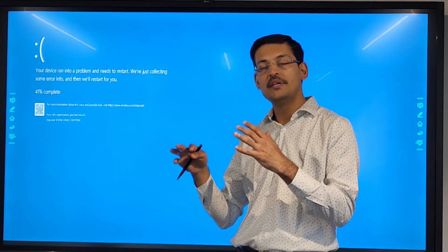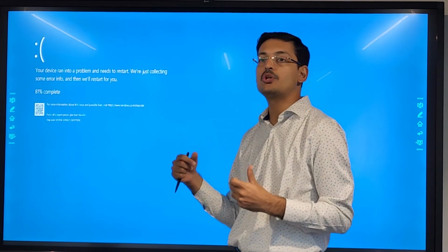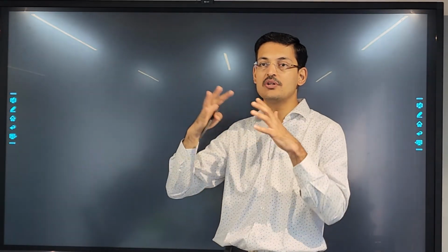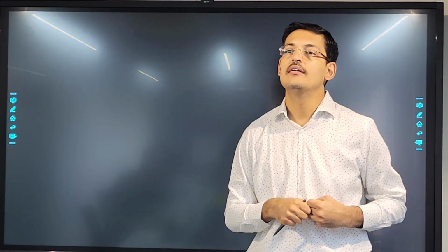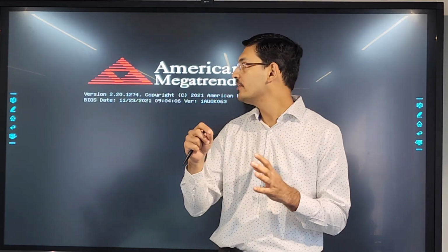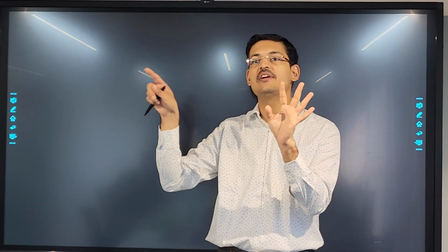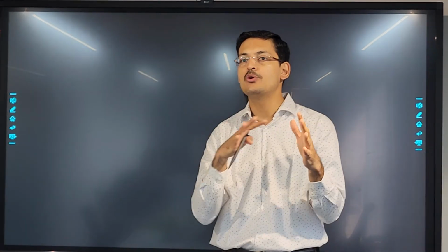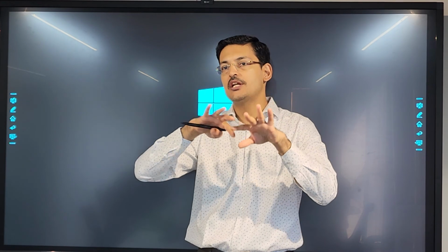So thereby this device, the Rootfix Anchor, is an advantageous fixation over the traditional transtibial technique, because there you have no modularity. You just have to pass sutures and tie them back on the tibia. Here you have modularity options. So you have one anchor with 4 threads, and these 4 threads can be used in different directions, in all sorts of permutation combinations to reduce it into its place. So technically you can do a better and more modular fixation when using this technique.